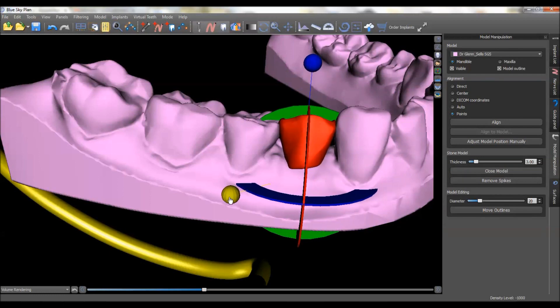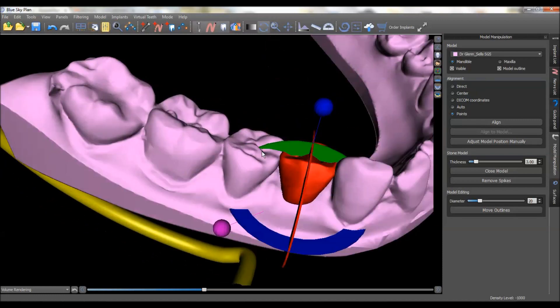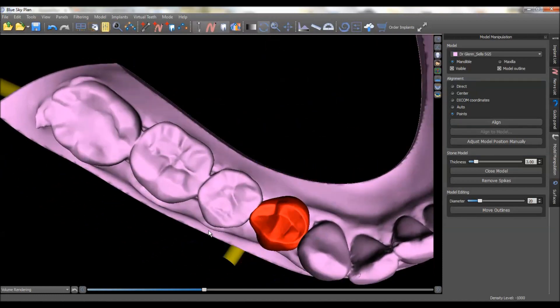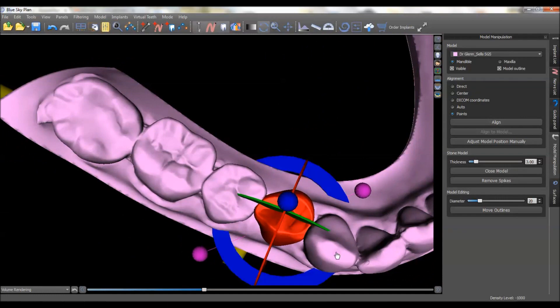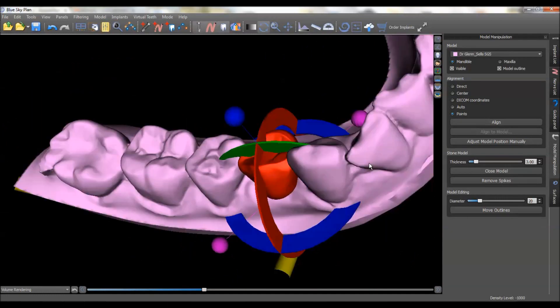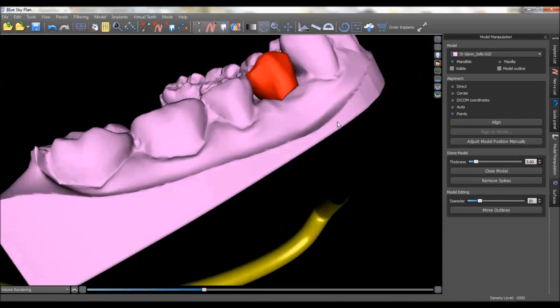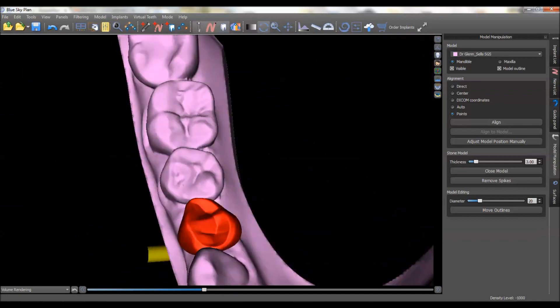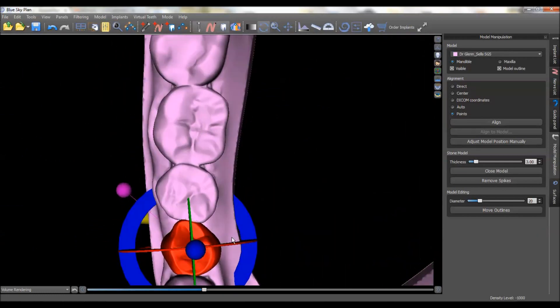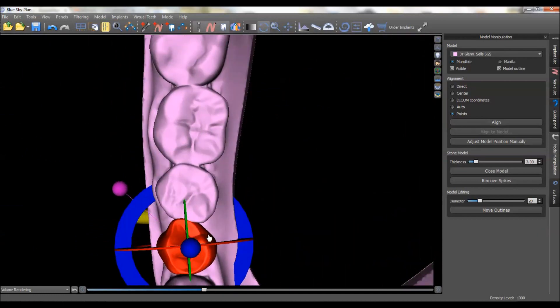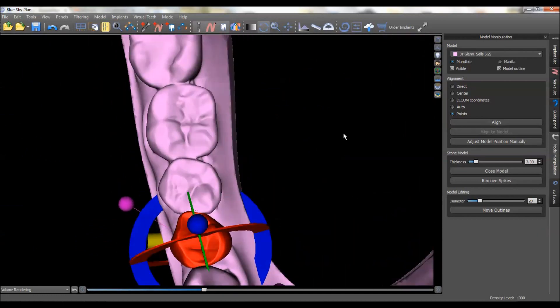This one can widen it, this one makes it taller or shorter. Again, for a tooth-borne case like this we don't really have to have this — you pretty much know where the emergence of the tooth is going to be. But just to demonstrate the functionality, I'm showing this. So we've got a tooth in position.